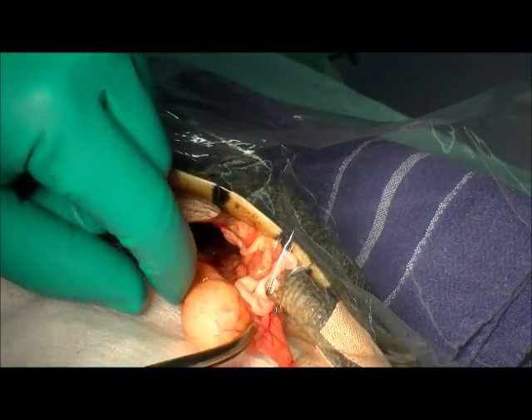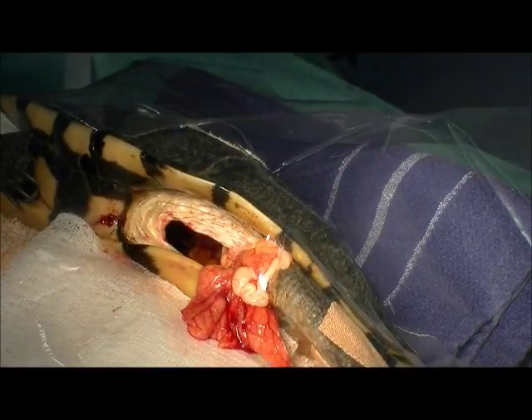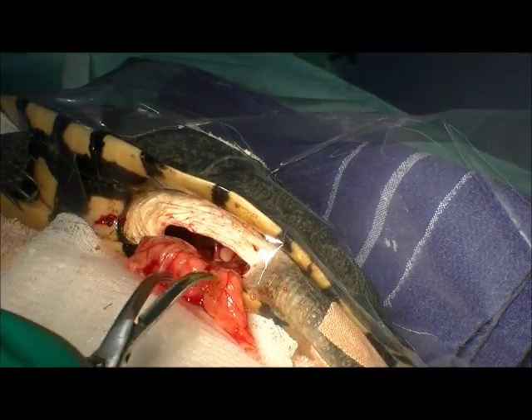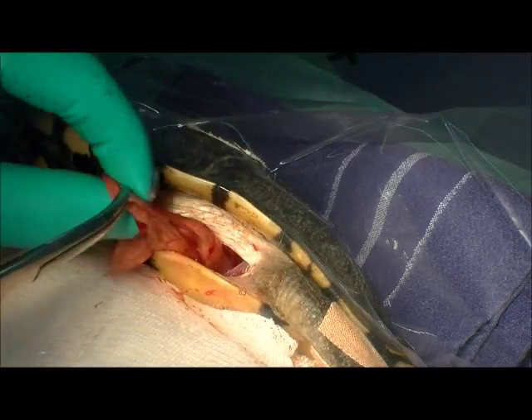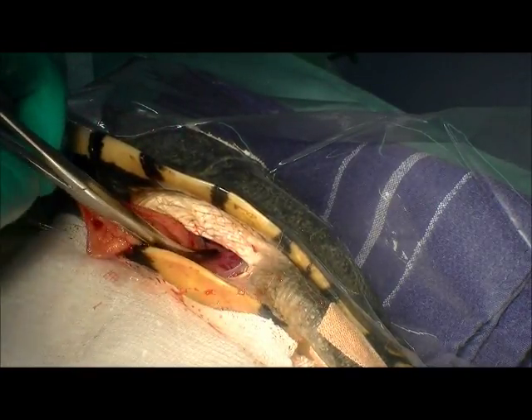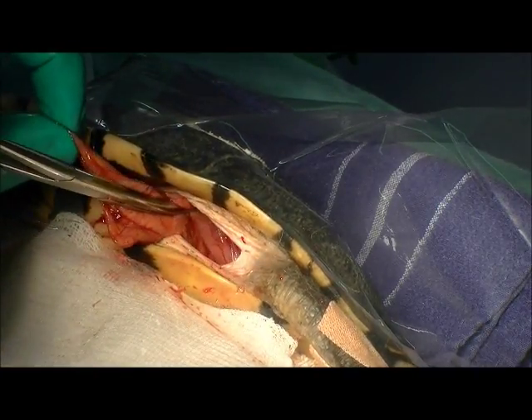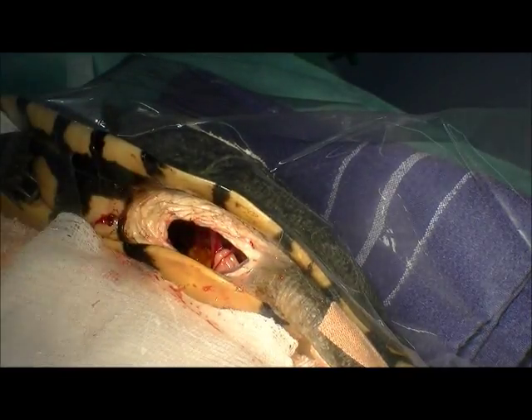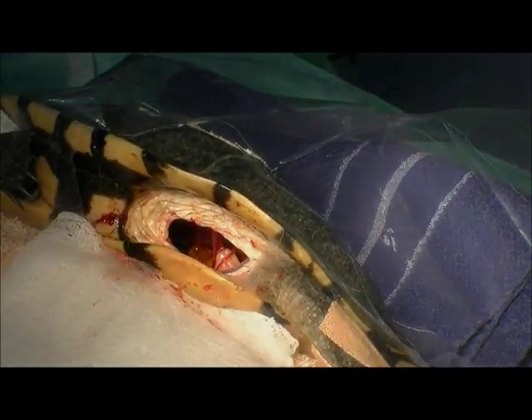We've certainly had turtles that swallowed fish hooks and other internal foreign bodies that we've taken out this way. That means we just have to worry about soft tissue healing rather than the shell — about six weeks healing versus many, many months. What we'll do is stitch up this side, roll her over, and go in from the other side to take the remaining eggs out. The oviducts are now empty on this side, so we'll tuck all that back in and stitch her up.